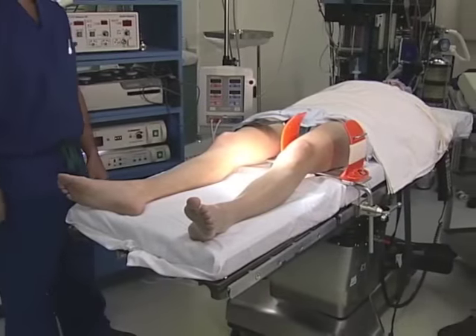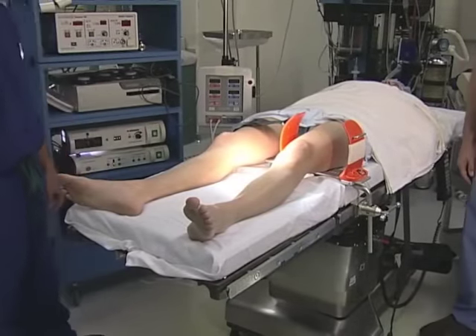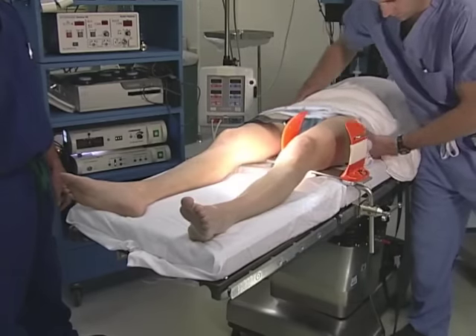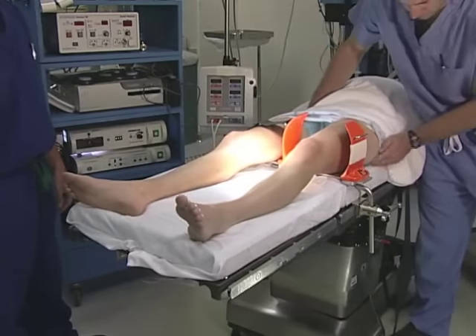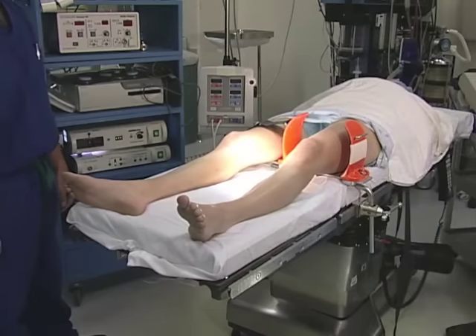The patient is positioned with their heels at the end of the table. We then move their pelvis to the ipsilateral side — the side that you're doing surgery — right to the edge of the bed, which gives us the best leverage for positioning the leg against the leg holder or post.